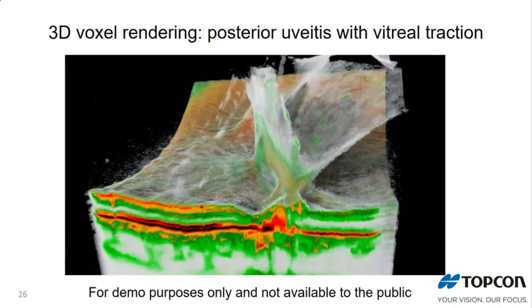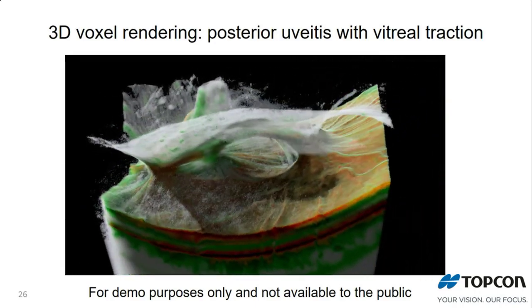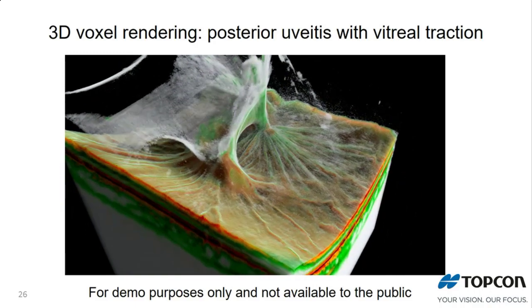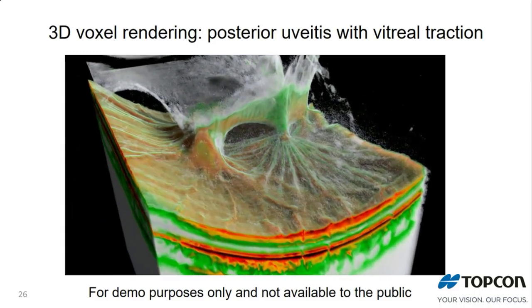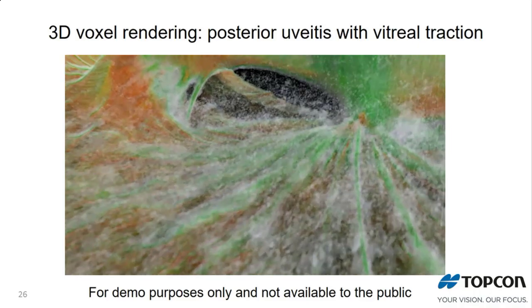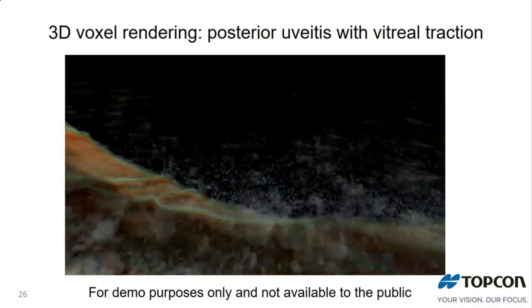And as you can see, these are inflammatory cells. So essentially what it is, is an inflammatory cell plus the reaction inside the vitreous. And theoretically, in the future, we're working together with a group in Spain who's creating a way of automatically counting those cells, and that'll give us an objective way of looking at uveitis. Again, that's of course still in a research phase.